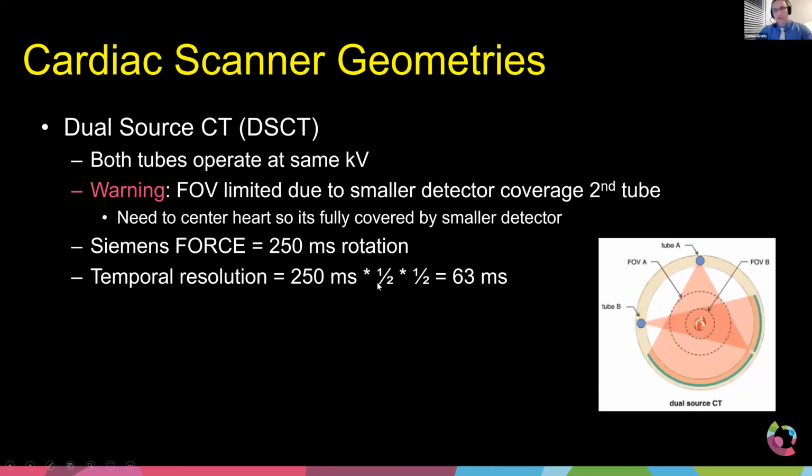If you've moved towards at least one scanner in your hospital that is these new dual source, or as we've talked about, the single 16 centimeter, those wide beam cone angle CT scanners, then it's probably best to move most of your cardiac imaging to these newer scanners because, as we'll explain going forward, they can produce a really high quality image at a really low dose.